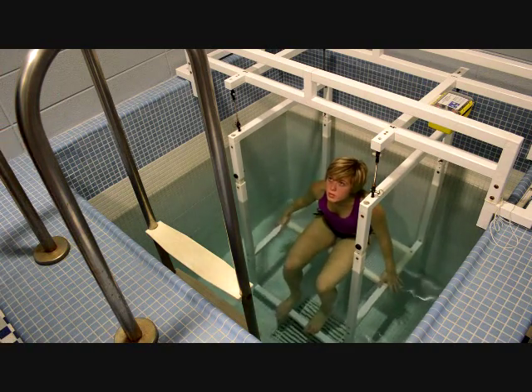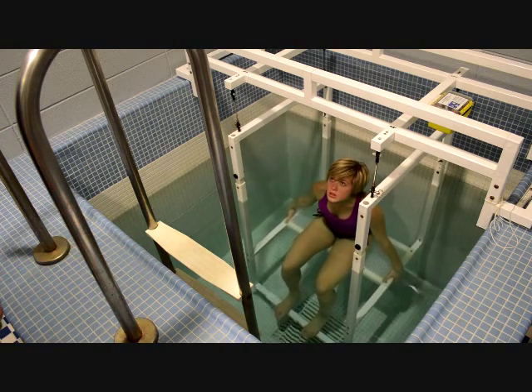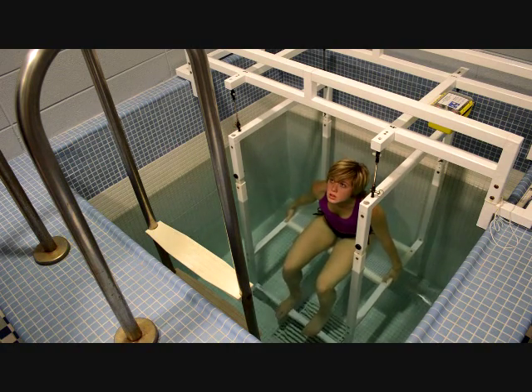Next, your hands — I need them there on the sides. I just need them there to anchor you to the scale. You don't need to pull yourself underneath.